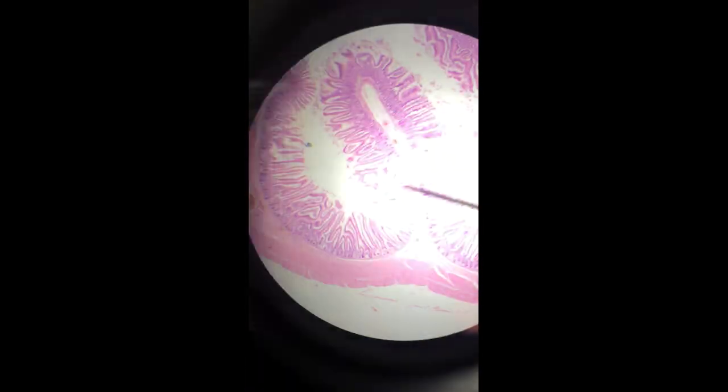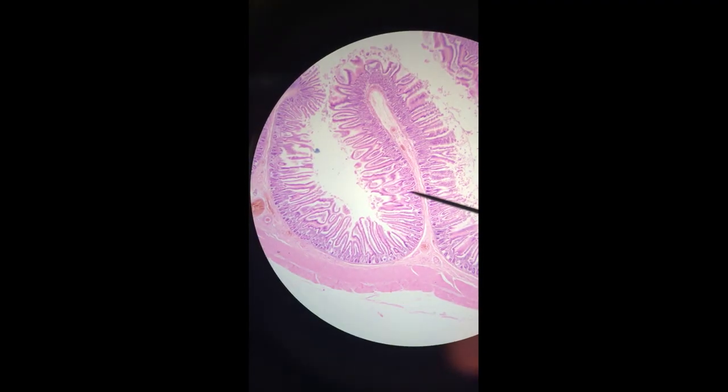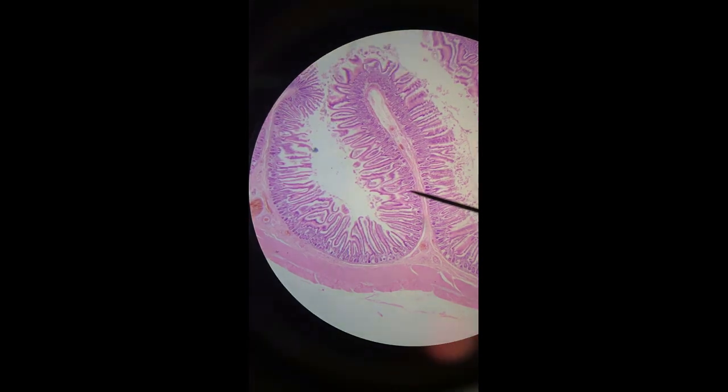So the big large fold is the circular fold and that happens because the muscularis externa down there at the bottom is shorter than the submucosa and the mucosa and so they cinch up to create those circular folds.